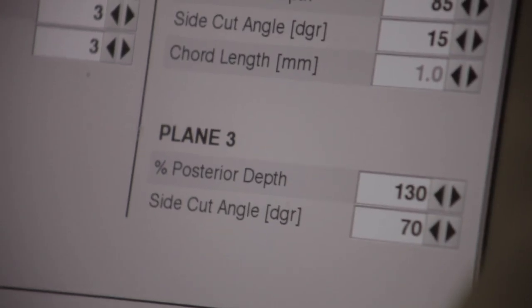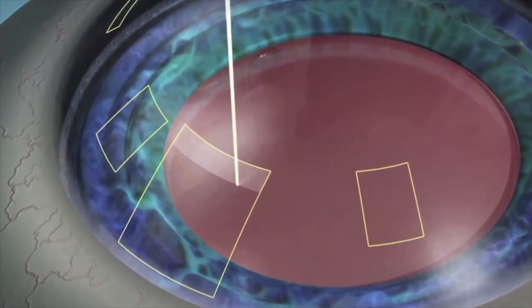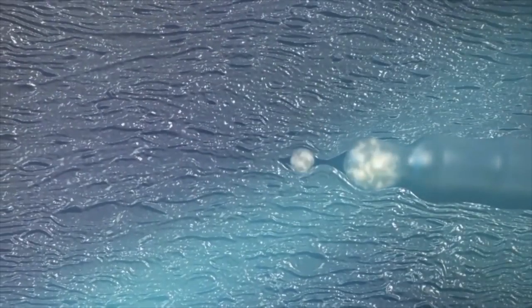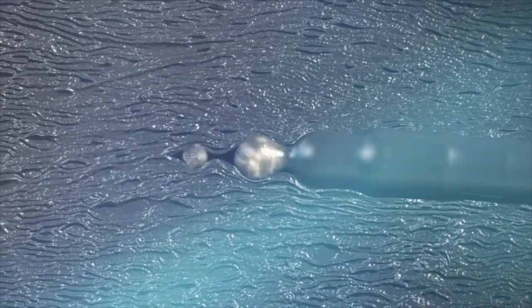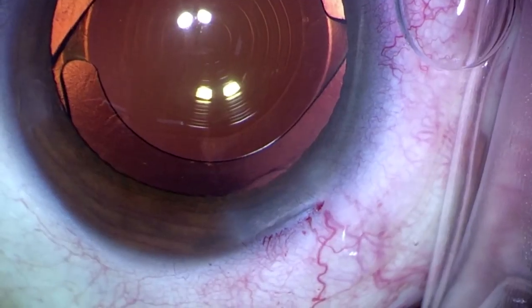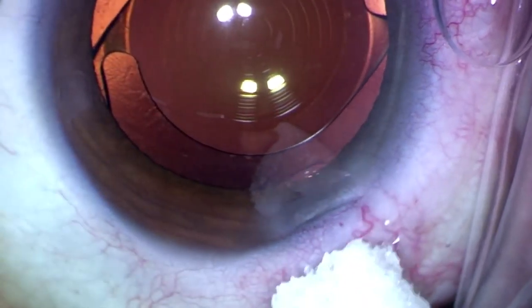Starting with the third plane, while certain parameters may override this third plane, a well-designed third plane allows for better self-sealing. Having a third incision plane also allows for use of the corneal tissue as support, thus avoiding common problems such as poor self-sealing or fish mouth internal incisions.